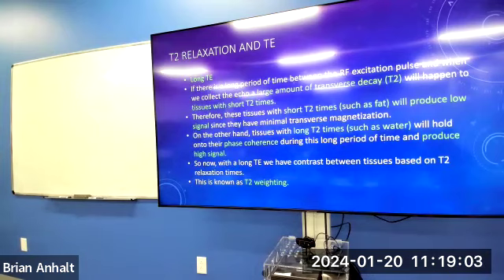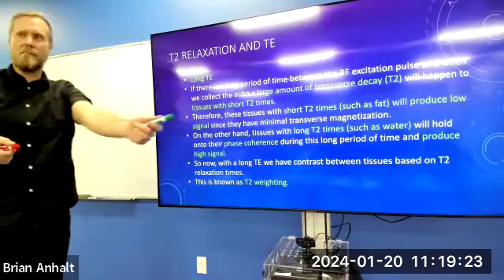Boom. We flip it, they go back together. Some of them are going to come more back into phase than others because of true T2 interactions, right? But I'm just going to pretend the 180 is happening. I'm just not going to show it because it makes it overcomplicated. Excite, we wait. One of them is going to decay back faster than the other one, right? So we wait a long period of time.